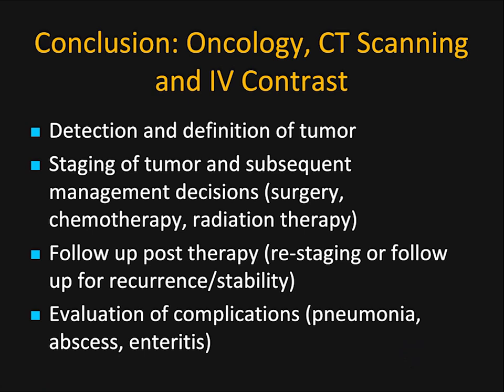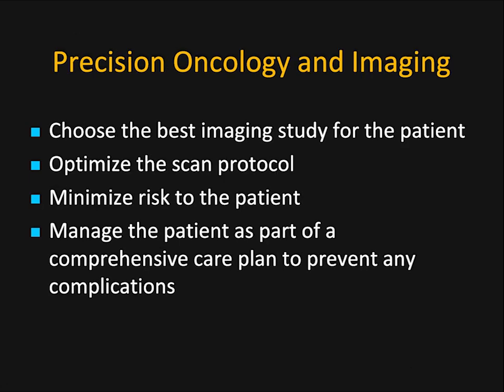So concluding then, we know how important CT is in oncology, from tumor detection to staging to management to follow-up to looking for complications. But when you use contrast, think about the fact that these patients are at higher risk. Choose the best imaging study. If CT is the study of choice, great. Optimize the protocol.